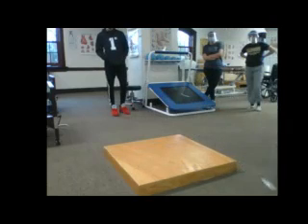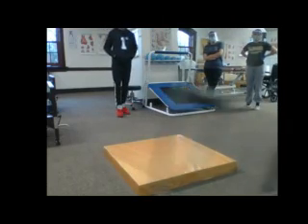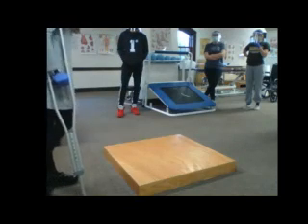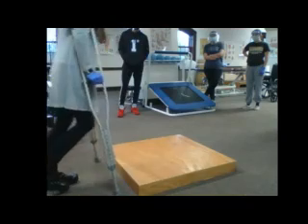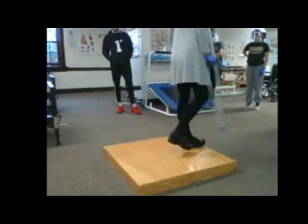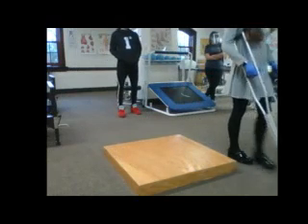And the same thing would be true with crutches as it is with the regular step. So the crutches would stay down, foot goes up, crutches come up. Crutches go down, foot comes down, and you move on. Okay?